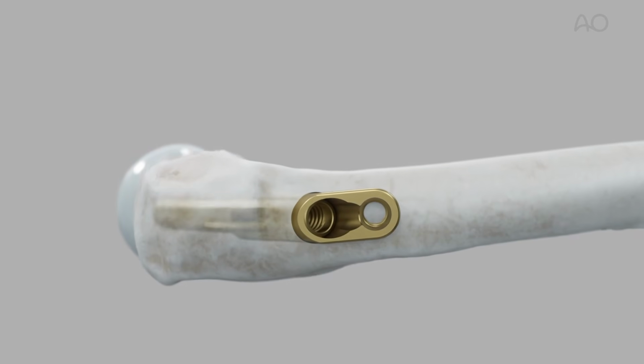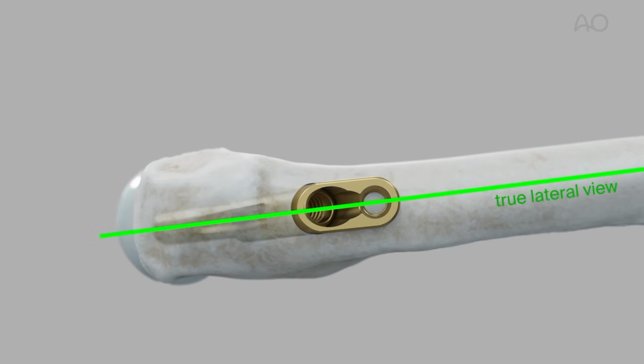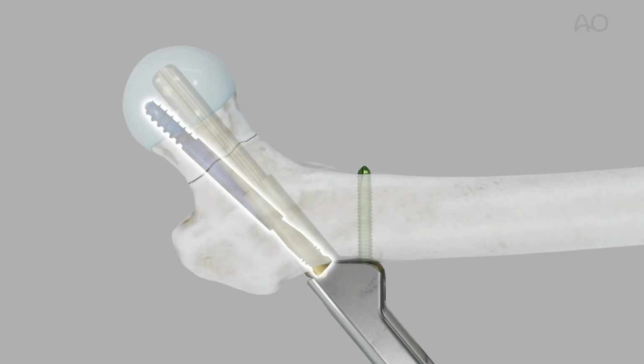Clinically, the correct plate positioning is verified under image intensification in the true lateral view, and the locking screw is inserted, followed by the anti-rotation screw. This screw insertion sequence is strongly recommended. Firstly, the locking screw, followed by the anti-rotation screw.